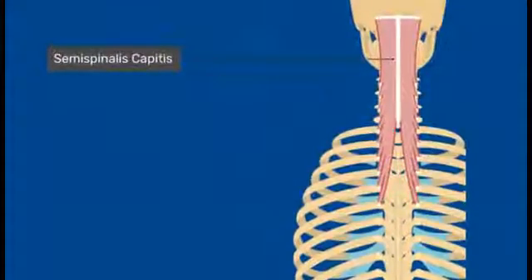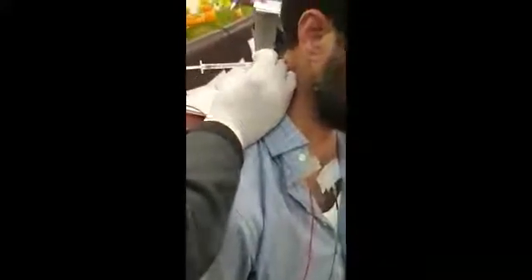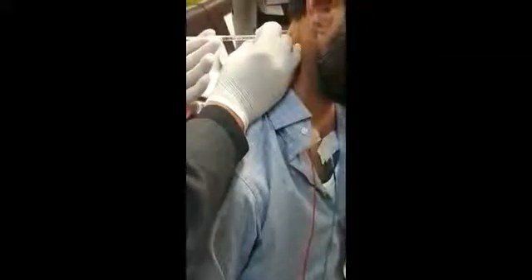In this video I'm injecting a patient for cervical dystonia, and right now I am palpating the right side for the location of splenius capitis and semispinalis capitis. Both of these muscles cause retrocollis or pulling back of the head, but they're also rotators. Splenius capitis is a strong ipsilateral rotator of the head, so if you have an ipsilateral torticollis, the splenius capitis can be involved.